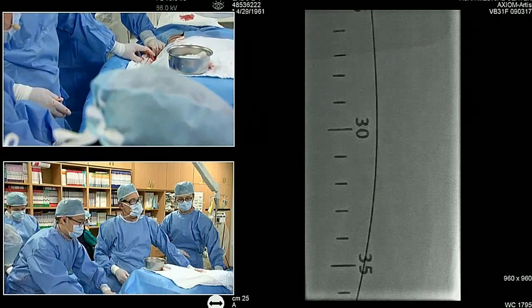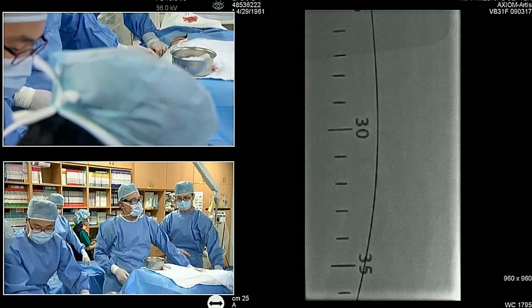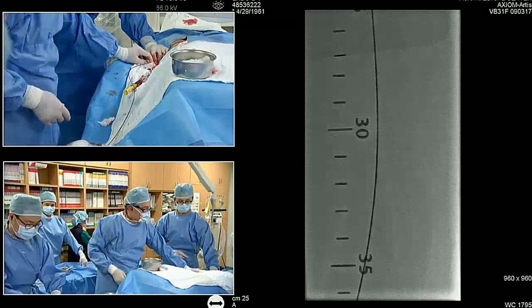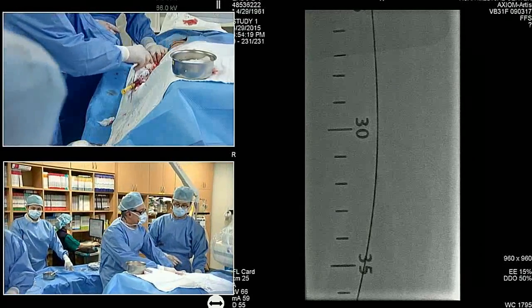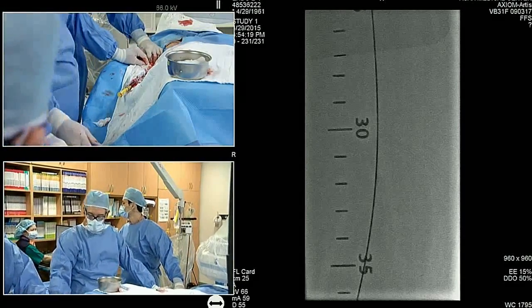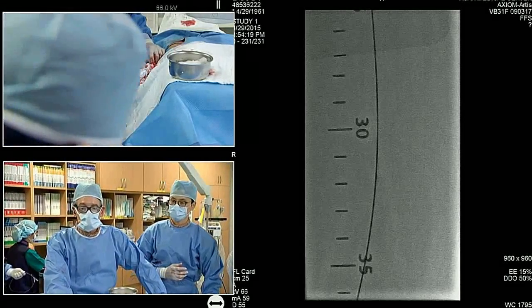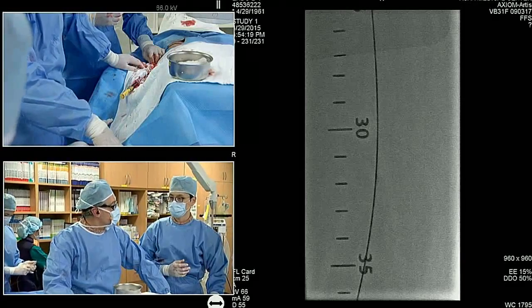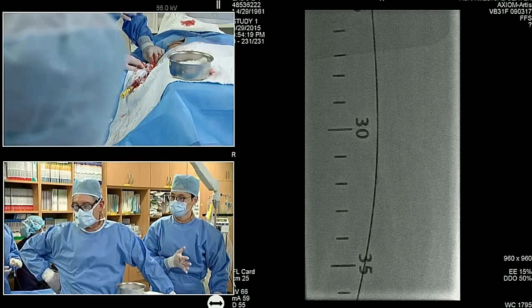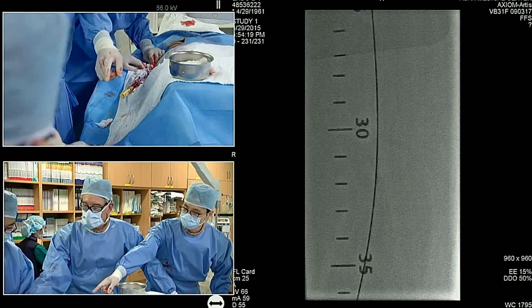So if your second balloon gets close, would you just do a DES proximally? I mean, it's going to be expensive no matter what, but what's your thought on the origin? That's a good point. Do we have paclitaxel, PTX? I mean, it's probably cost effective. I don't know what the cost differentials are here. We have it? I think that's a good idea, Lawrence. What about this?